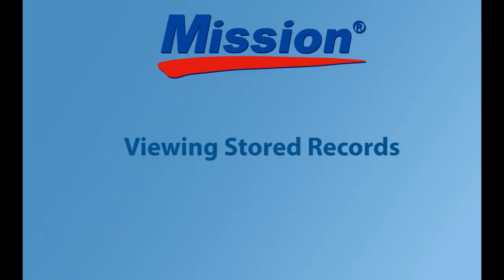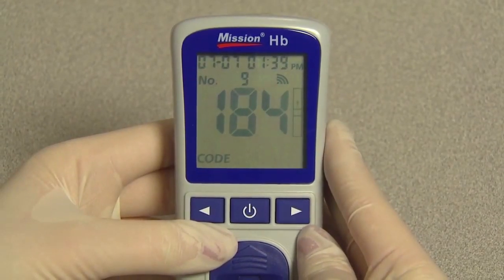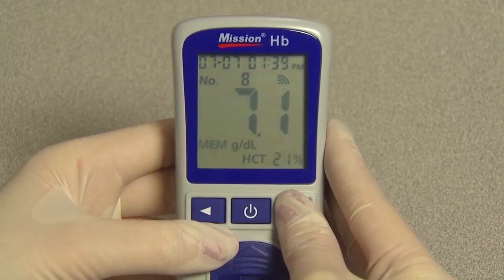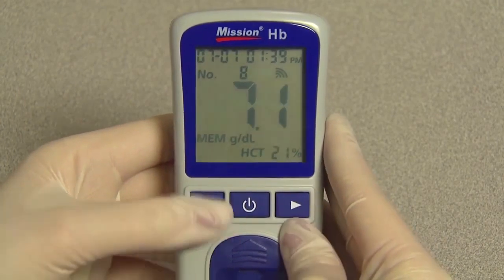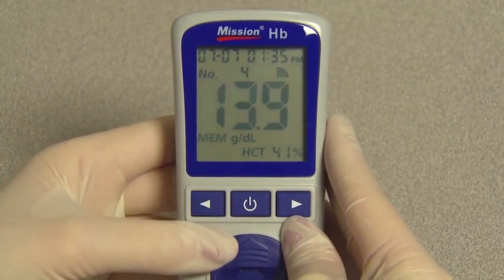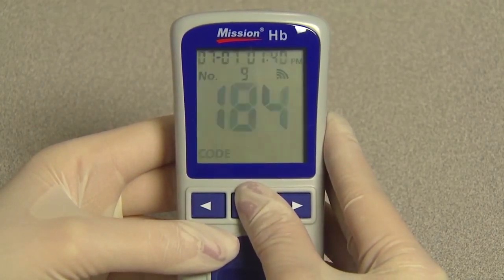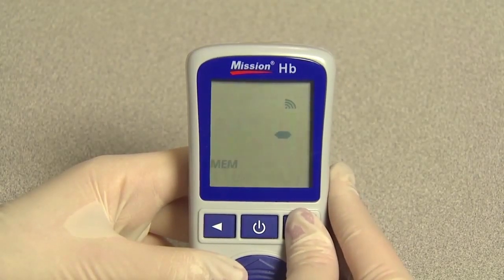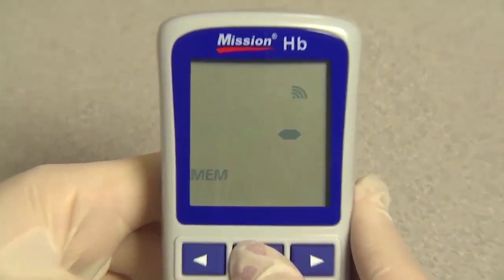Viewing stored records. To view stored records, from the initial screen, press right or left to show the first record. Press right or left to view each record in date, time, sequence. Press and hold the power button to return to the initial screen. If no data is stored, the meter will display 1 dash and MEM.